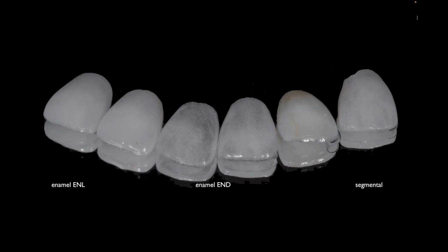When I go to the END, which is much more translucent, you'll notice that not only does it appear translucent at 2/10 of a millimeter, but as I come up to 3, 4 and 5/10 of a millimeter, I still have all that translucency. So what's that going to mean? That when I put that over a tooth, I'm going to get a lot more bleed through, or a lot more light transmission of what's behind it.